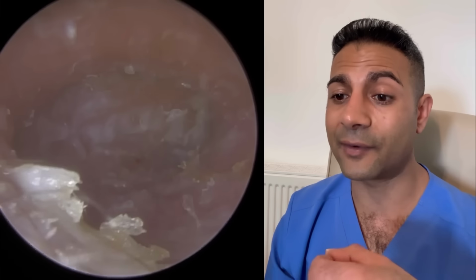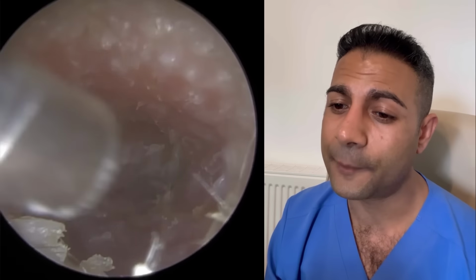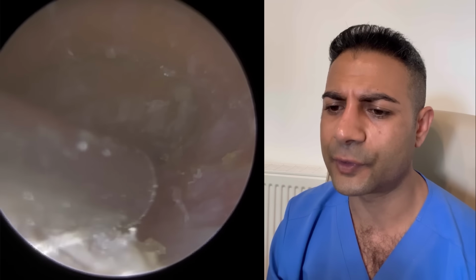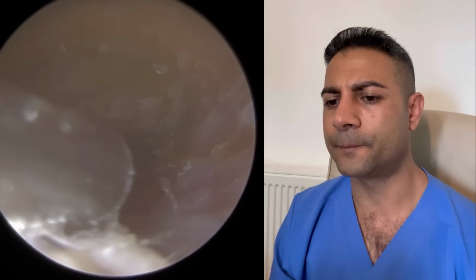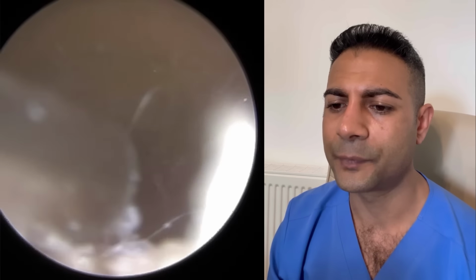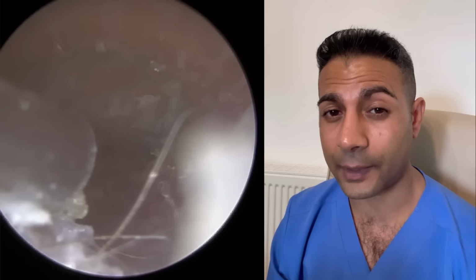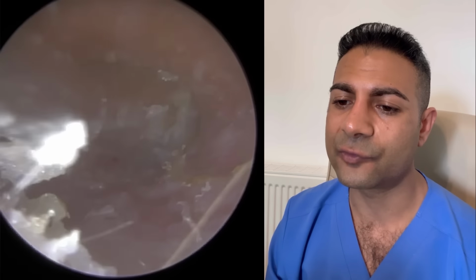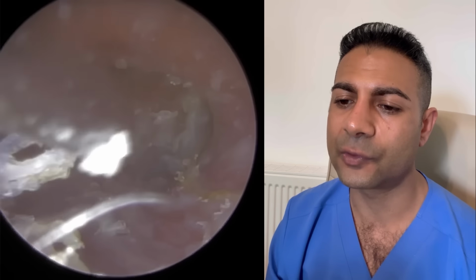I just found it gave me better access in the ear. I think this patient's got a slightly longer ear canal than most people, so using that method, I just had better insertion of both the endoscope and the instrument, which is really, really important. So we're just working more laterally near the entrance now, just peeling away the skin, going towards the eardrum.